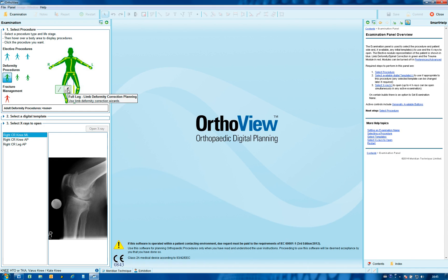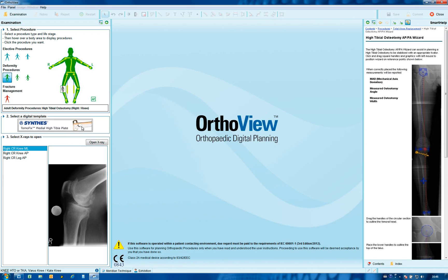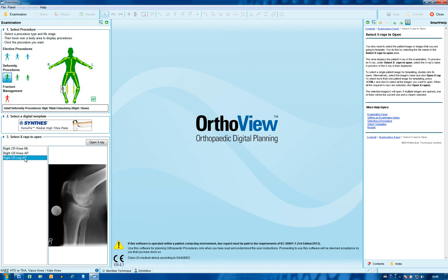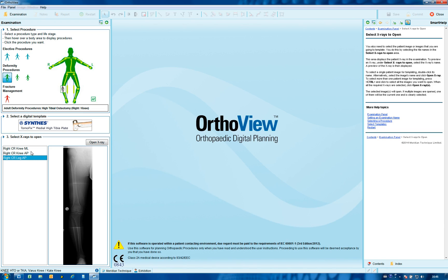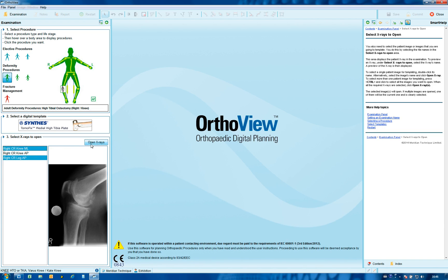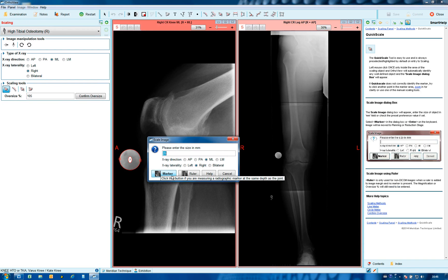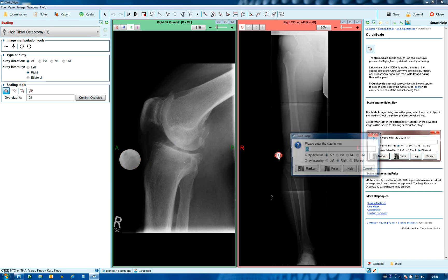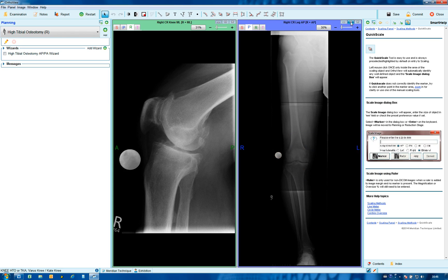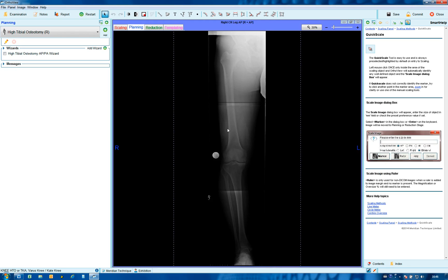Choose high tibial osteotomy — a plate will appear which can be altered later depending on the cut planned. Open images of interest; planning is normally done on the full leg and sometimes a short leg can be viewed, and also a lateral image using control. Two images are selected and opened.